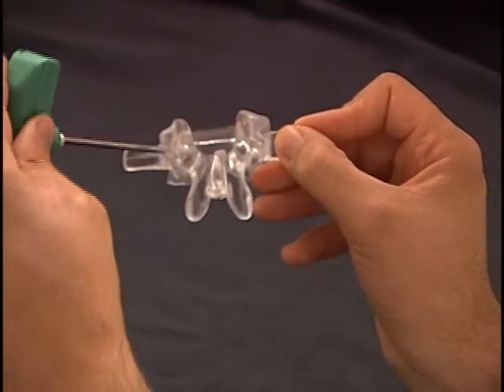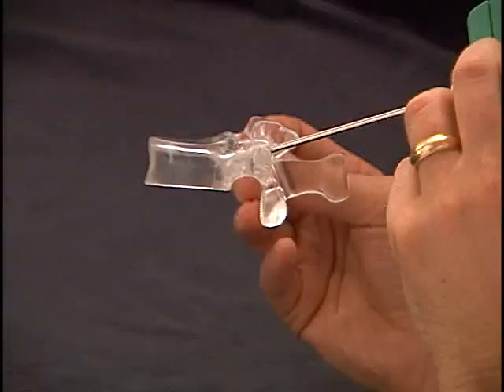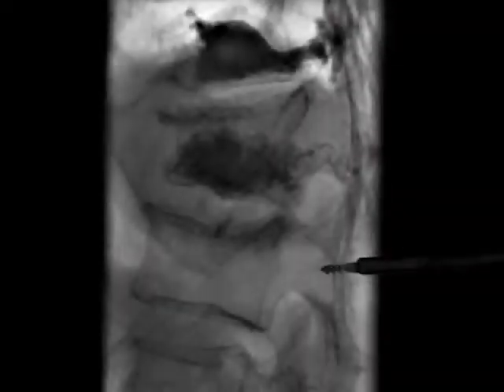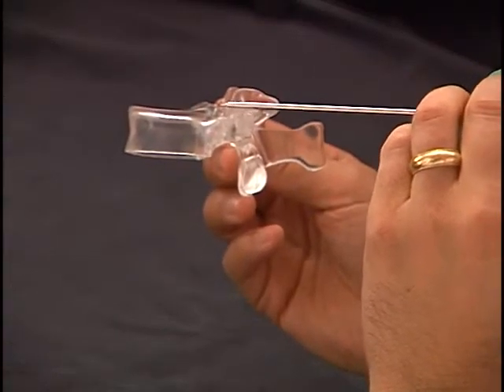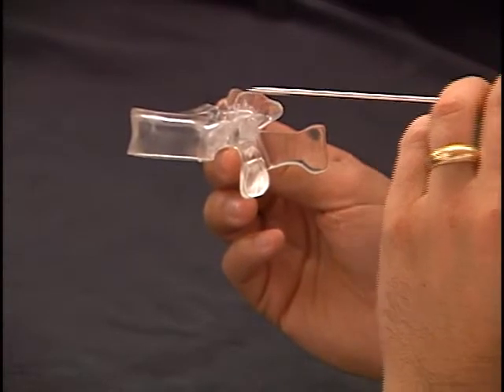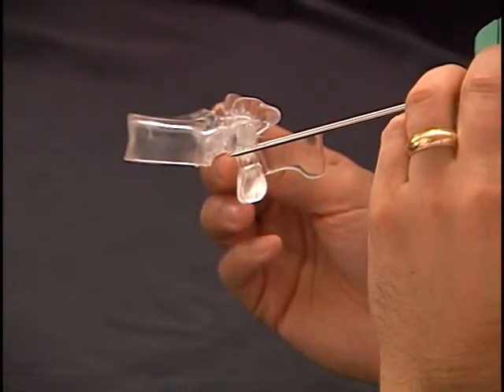Once the entry point is chosen on the AP fluoroscopic image, I lightly tap with a mallet to seat the instrument into the bone. The lateral fluoroscopic image then allows me to extrapolate the trajectory of the instrument. The appropriate trajectory should be through the upper half of the pedicle into the vertebral body. A trajectory that is too superior will result in fracture through the superior end plate, while a trajectory that is too inferior results in fracture through the inferior pedicle and nerve root injury.